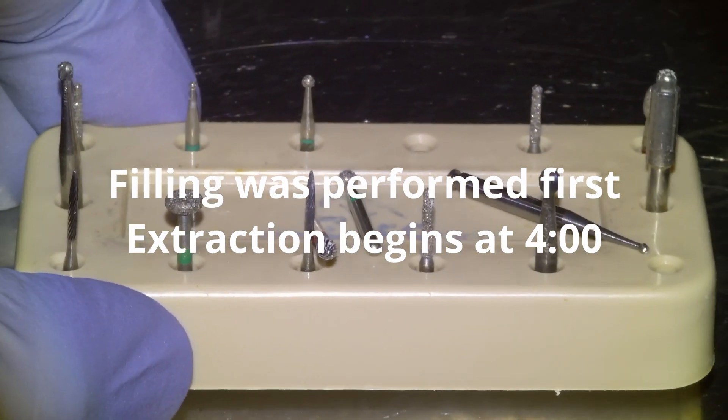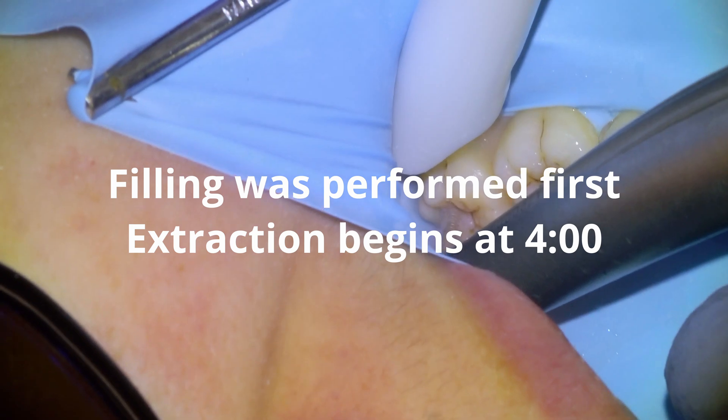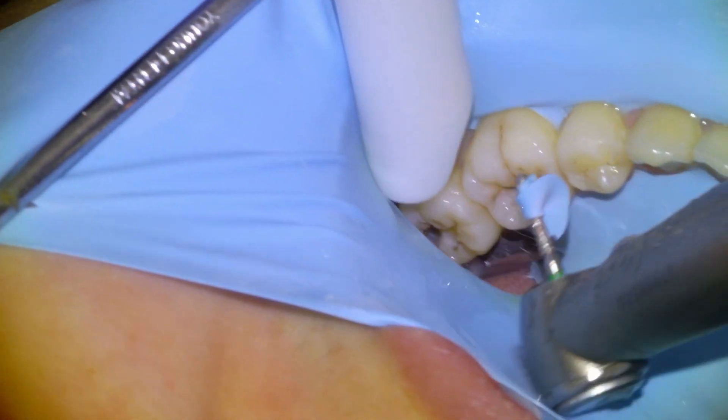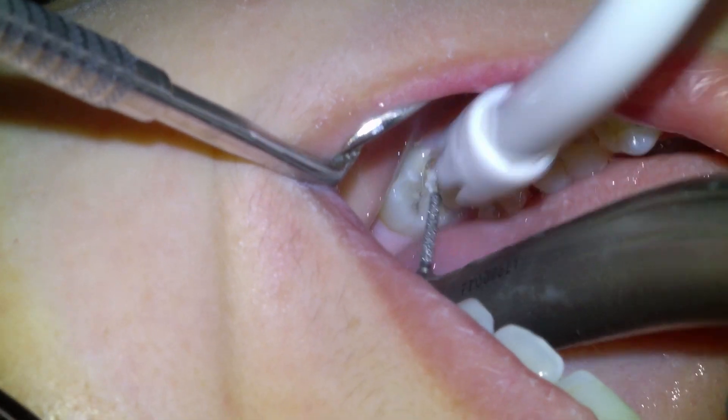I'm going to endeavor to use a rubber dam for this restoration, going with a KS-1, and begin removing the tooth decay — but we ended up shredding the rubber dam. The decay was too gingival, so we decided to proceed without the rubber dam.